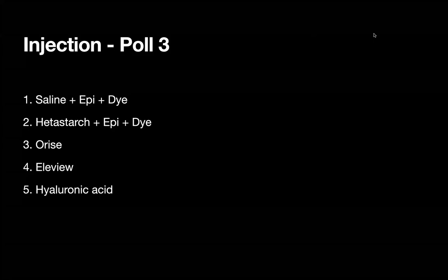Any comments on this? Roy, what do you think? I think your choice is good. Typically, we don't add epi, but in this case, if you feel like, oh, okay, maybe the risk of bleeding is higher, I need to add a little bit of epi, that is good.